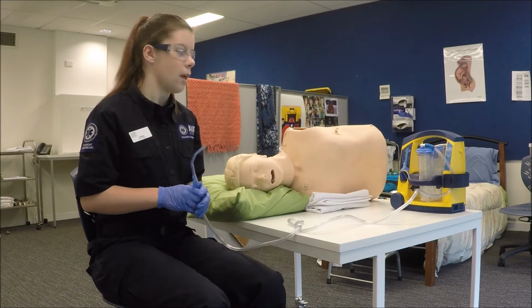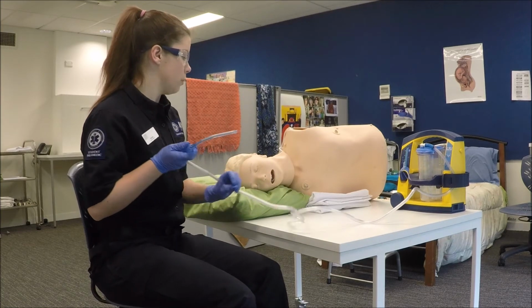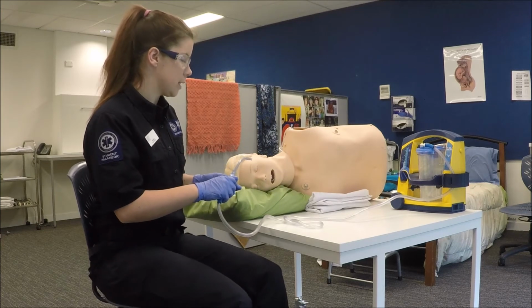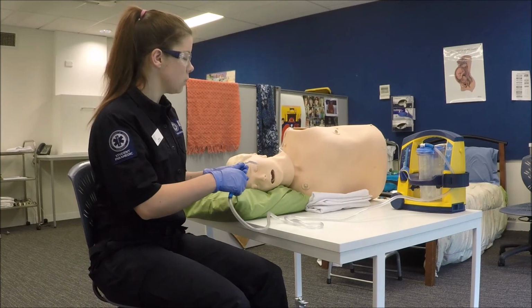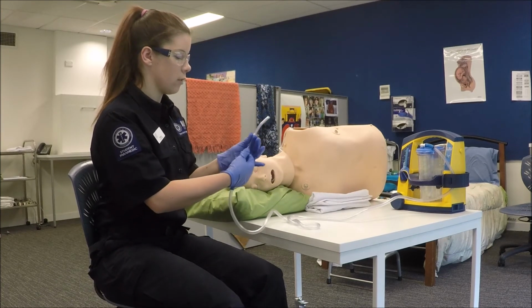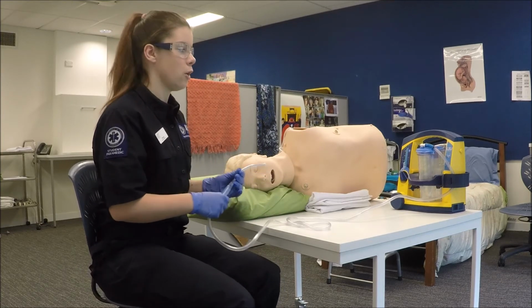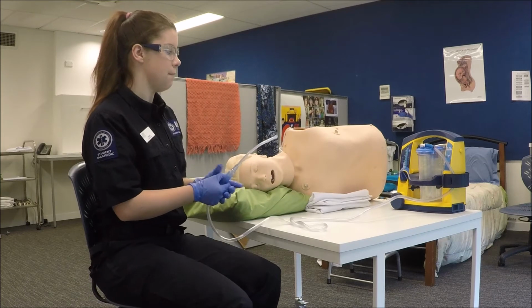tissue trauma. So when we use suction, we insert into the mouth only as far as the eye can see, and then on the way out, we use a rotating movement and cover this hole to complete the suction, and we only suction on the way out, and only for up to 10 seconds at a time.